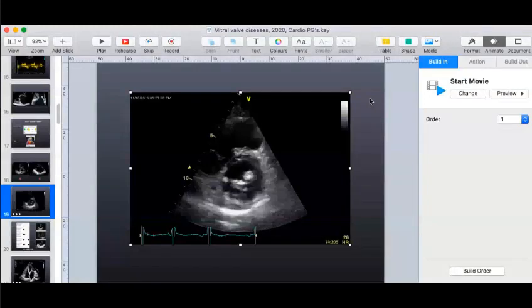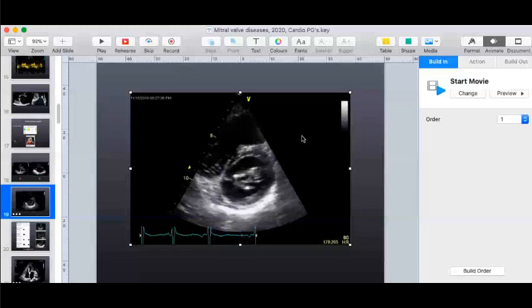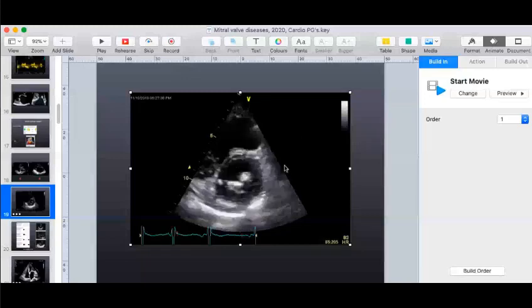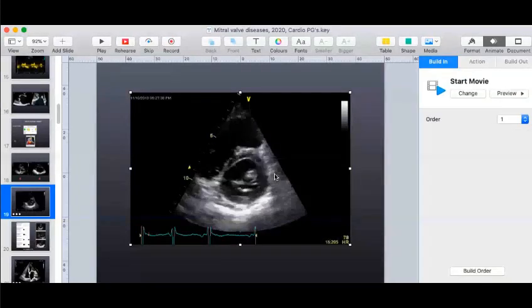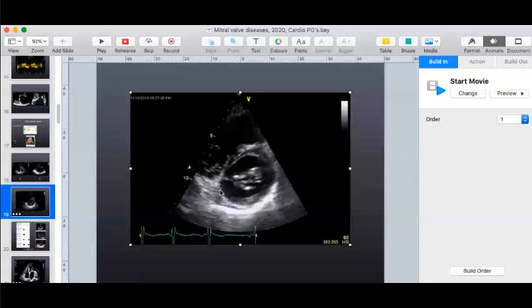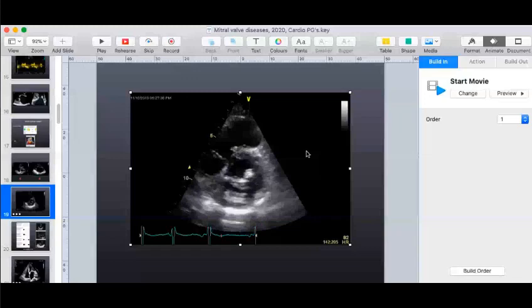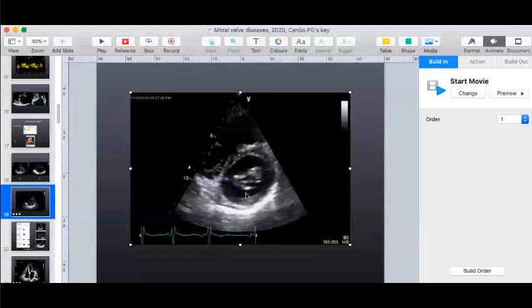Okay. So, as you said, the main finding here is commissural calcification. That is the important point. So, when you see something like this, immediately say that there is commissural calcification. And of course, as you said, this is the anterolateral commissure, and this is the posteromedial commissure. So, there is commissural calcification here. And in addition, just for the sake of completion of how to interpret this image, you can see these small specks of calcium here.